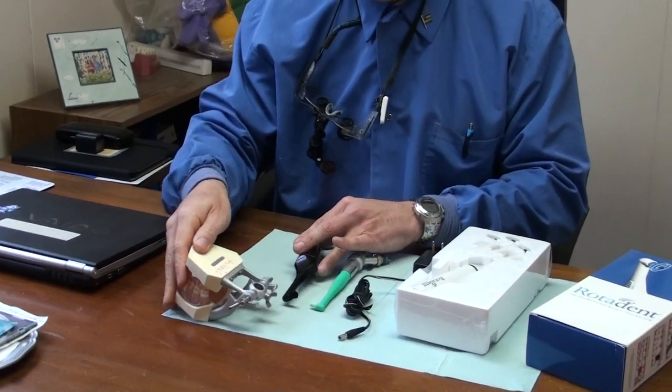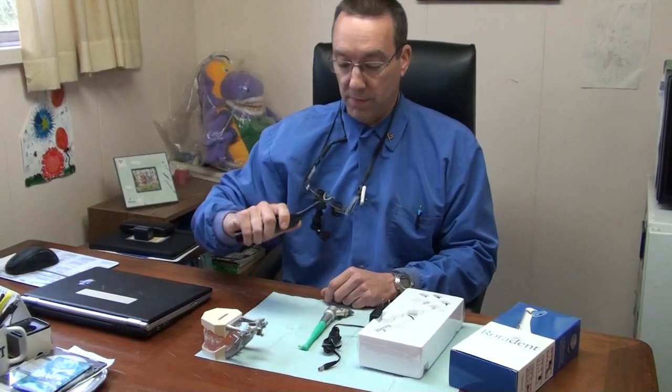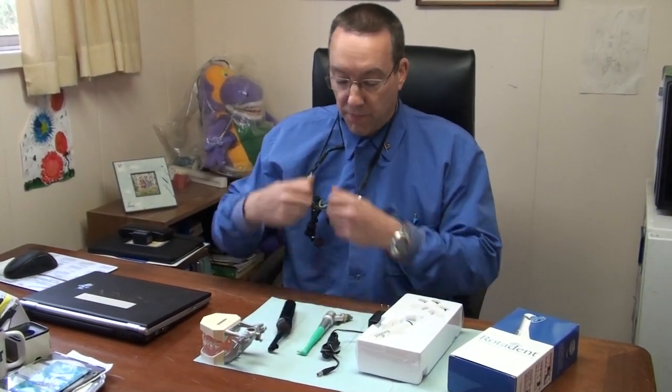We've found that this Rotodent appliance has been very helpful, especially with patients with periodontal disease and patients that have implants or braces, where it makes it difficult to clean the teeth, or someone that's having problems using their hands. It fits great. And flossing and tooth brushing can be difficult if you have arthritis.